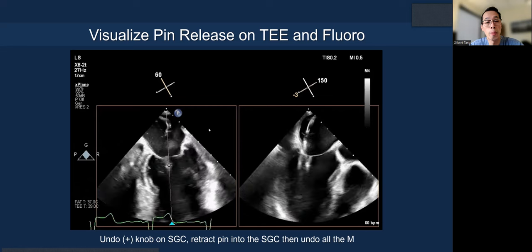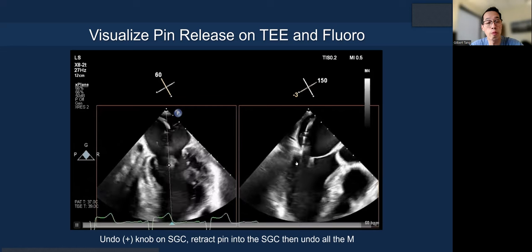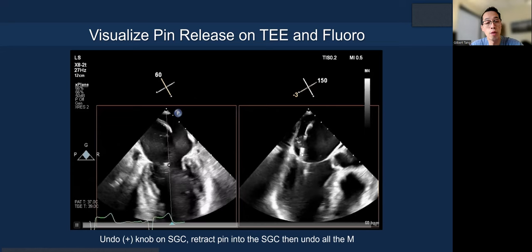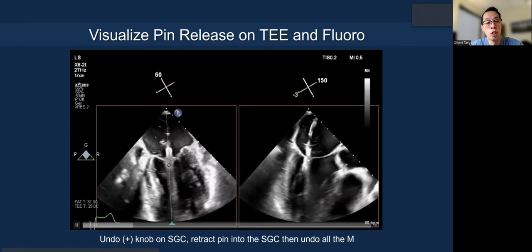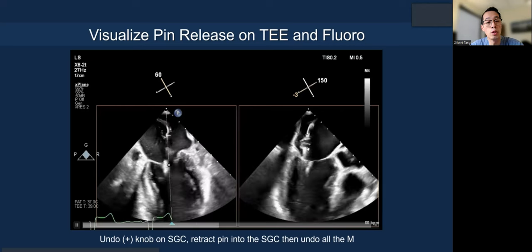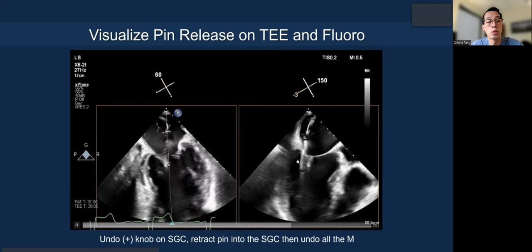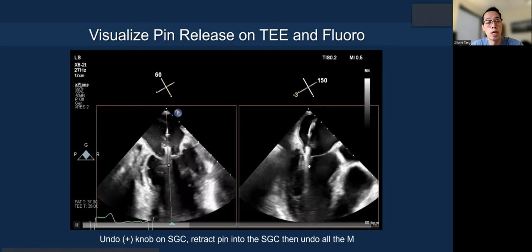For pin release, be very careful — because you've been doing a lot of posterior guide torque to grasp and offset during closure, you want to counter-clockwise rotate the guide a little bit so that the needle when you deploy doesn't hit the posterior part of the left atrial wall.